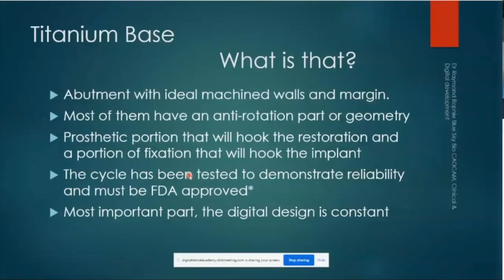Good. Why are these important? Because these have really been tested, like with fatigue tests and cycles, and have been working for way more times than any of your patients will ever have. A lot of people talk about the titanium bases not being the most reliable parts. Well, guess what? They are.